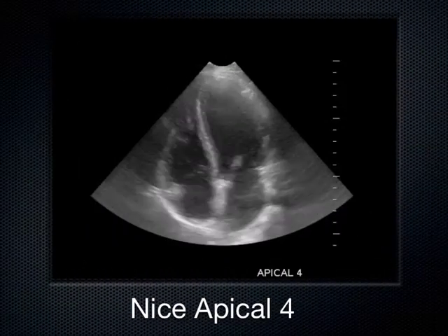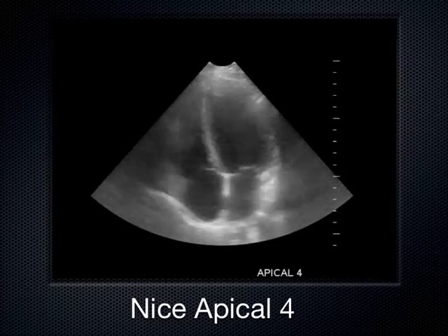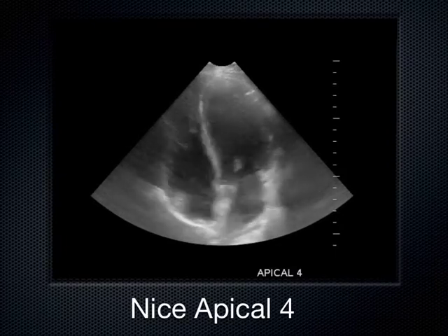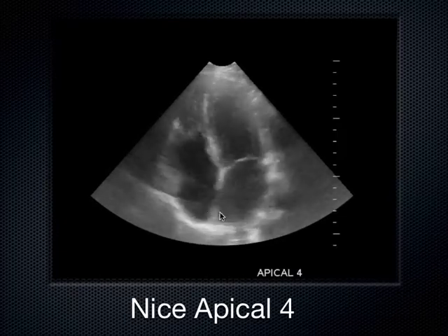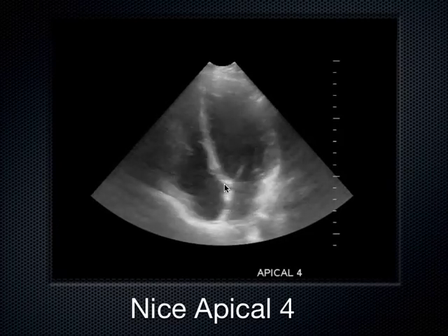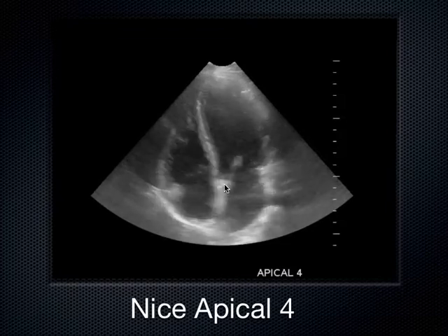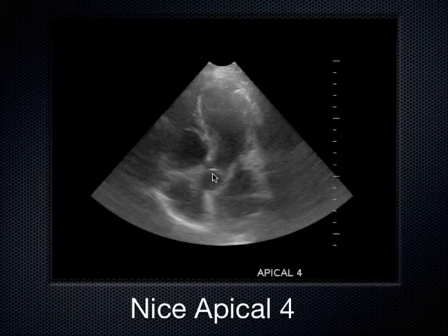This is a normal apical four-chamber view: left ventricle, right ventricle, right atrium, and left atrium. Occasionally the aortic valve comes into view — when it does, we call it the apical five-chamber view, the fifth chamber being the aortic valve. So we see LV, RV, RA, LA, and the aortic valve.